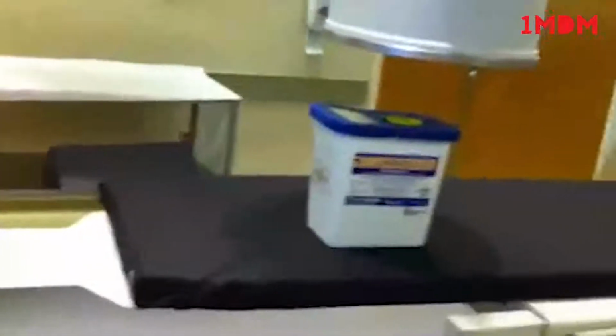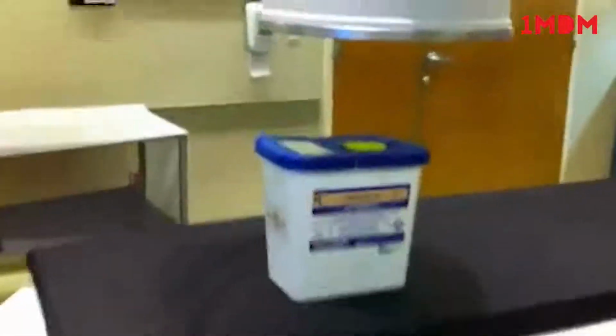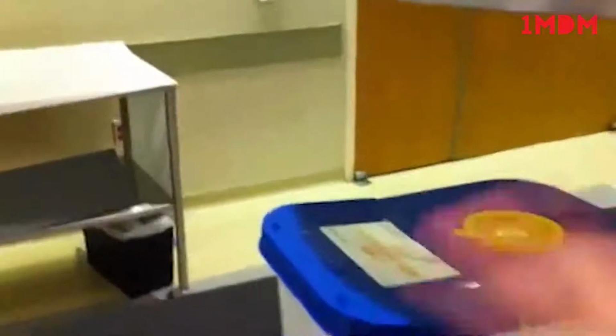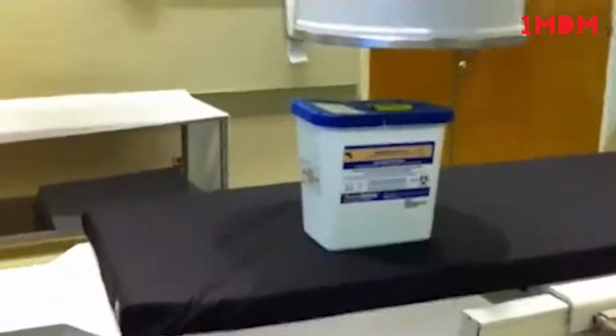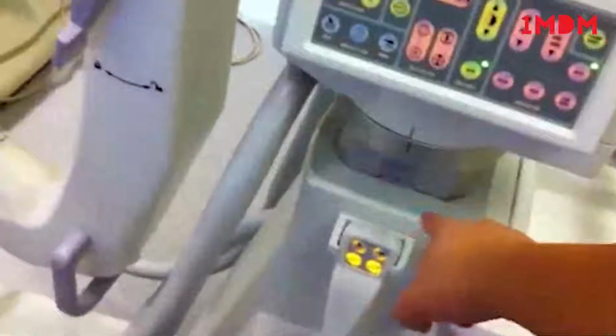This will increase my OID. You may need to do this in case the doctor needs to put a needle in the middle, or do a procedure and get their hands in, make a few cuts, whatever they need to do. And if it's permitted, lower the machine back. Get the II as close as you can to the patient. And that's as far as it goes. You see the height there is 0 right there. And you can shoot the picture.